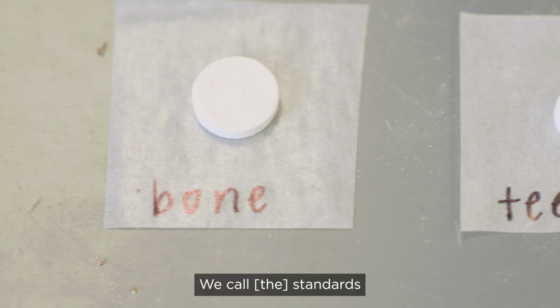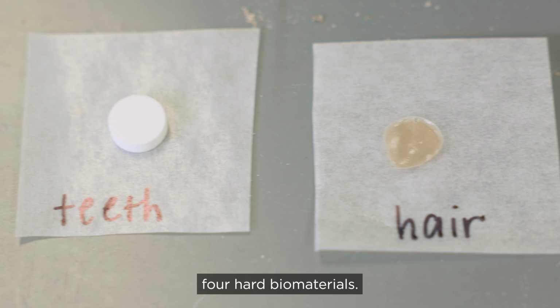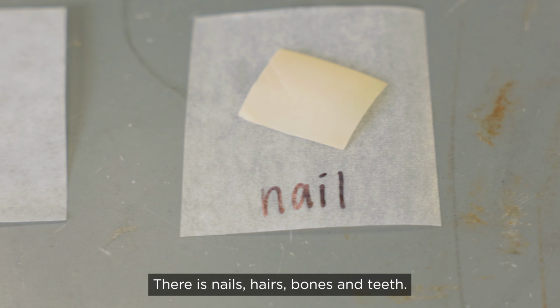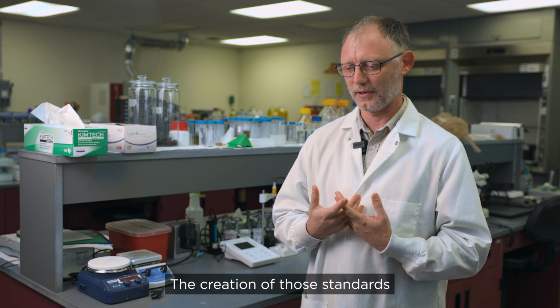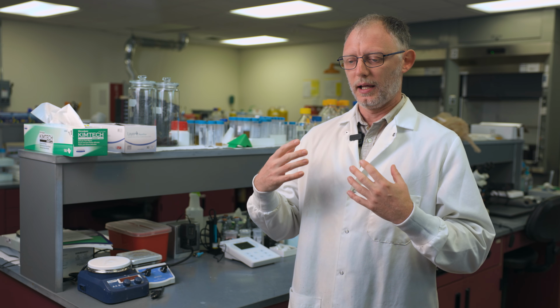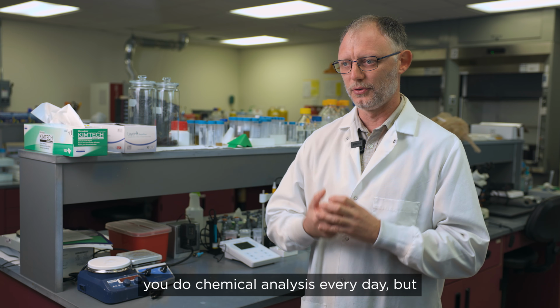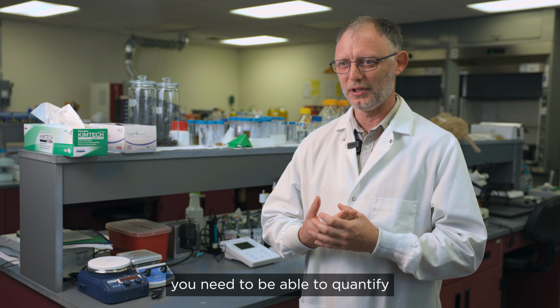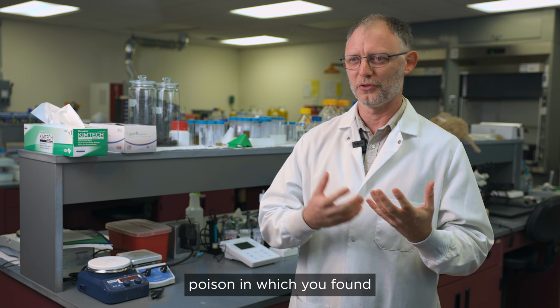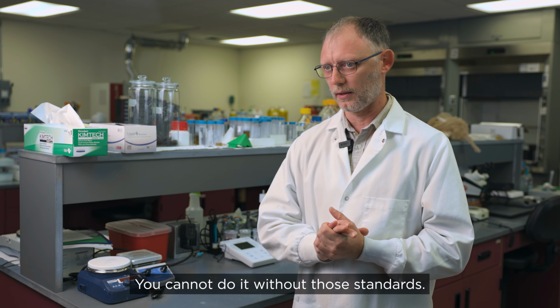We call those standards the Fantastic Four because there are 4 hard biomaterials: nails, hairs, bones, and teeth. The creation of those standards is very important because, especially in toxicology, you do chemical analysis every day, but you need to be able to quantify the amount of either poison that you found or drugs that were used, and you need standards for that. You cannot do it without those standards.